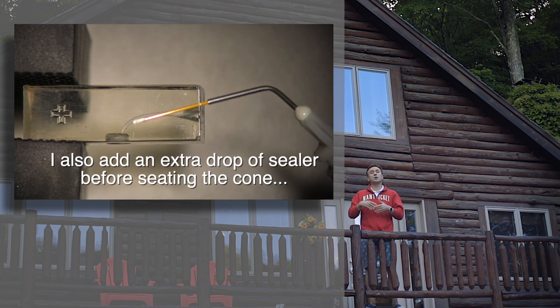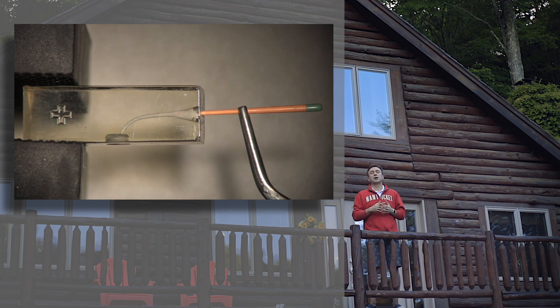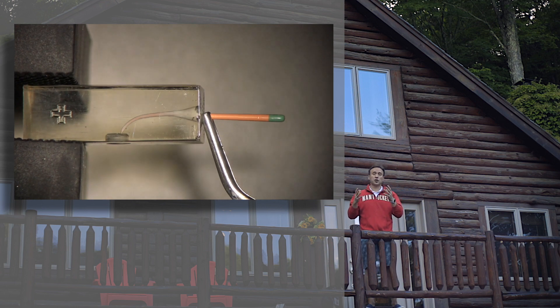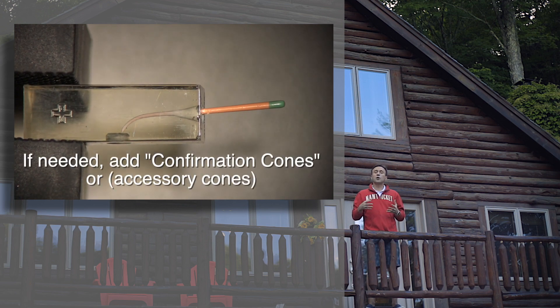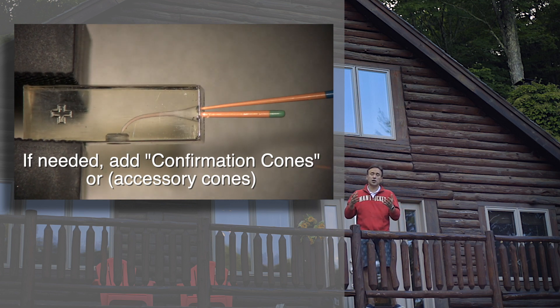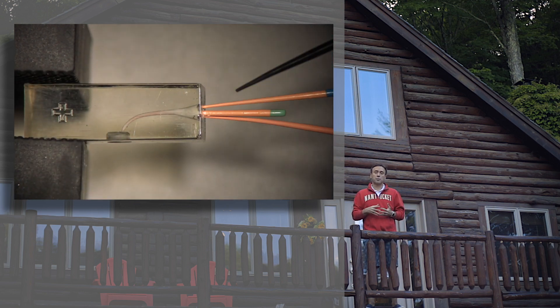Once the canal is completely coated, you coat your gutta-percha cone as well. Once the cone is coated, slowly seat it to the apex, allowing a little sealer to escape back up around the cone. Once the cone is seated, if you have a very tight canal your shape will allow only one cone; but if you have an oval canal with room on the side, go ahead and add additional cones to fill those spaces. You don't have to do lateral condensation — the cone itself is doing the condensation for you. You're filling spaces where sealer has pooled with the gutta-percha cones.